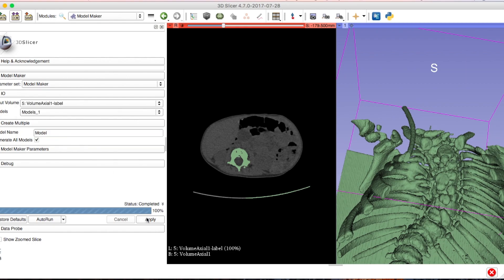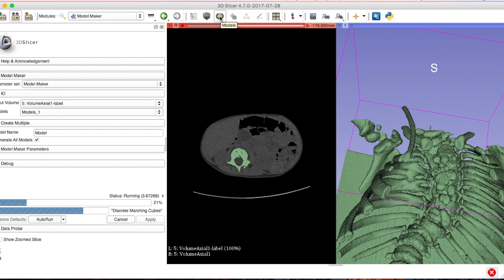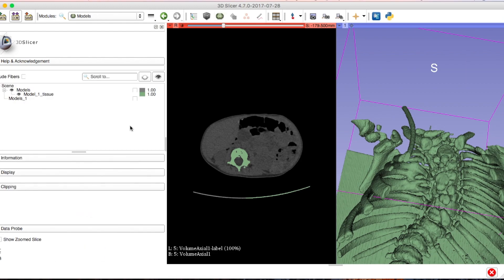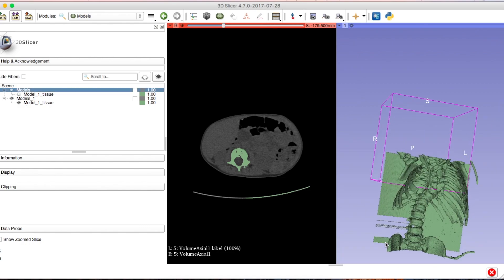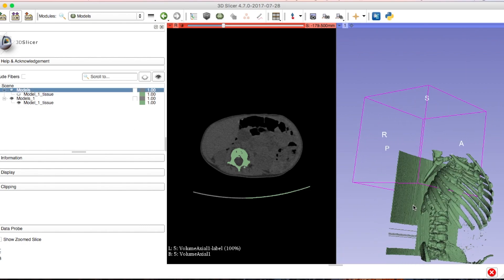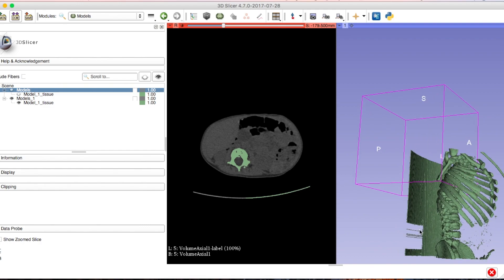As I erase, it's going away in the slice view, but it won't appear updated on the 3D model until I create a new model. When I'm done, I'll go to Model Maker, create a new model, and I can hit the green icon at the top to go to my new models or type 'Models' in the search bar. Click the eye icon of the model right above the one I'm working on to see what I've done.